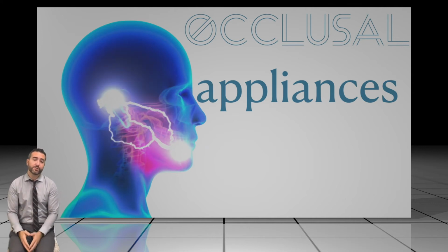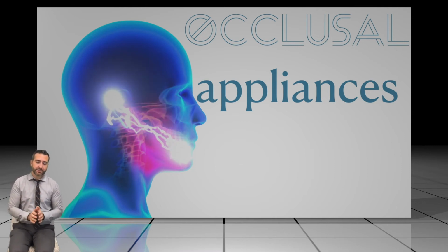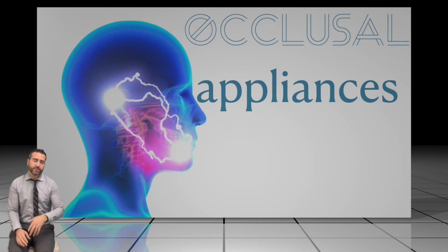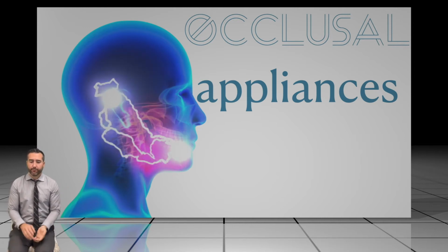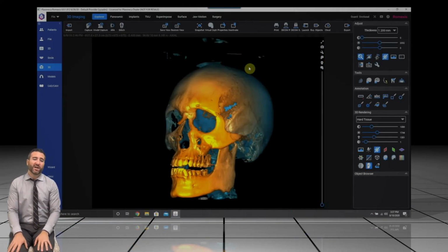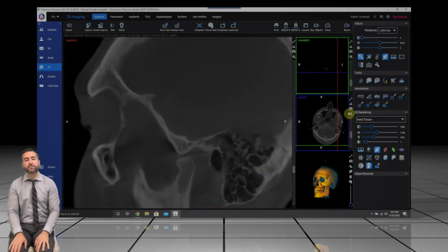We could do occlusal appliances that are world-class because a lot of my patients are coming in with extreme occlusal issues, and I dread taking impressions and sending these off to a laboratory and wondering when I get it back, how much adjustment I'm going to do on it. But I have all the control in my office, and so on my patients that have severe occlusal issues, I'm going to take an ultra low dose CBCT.